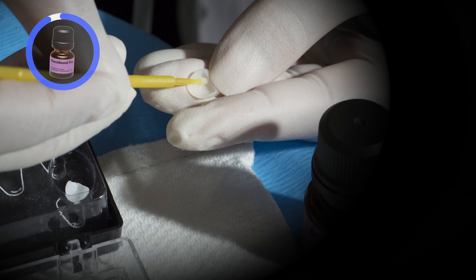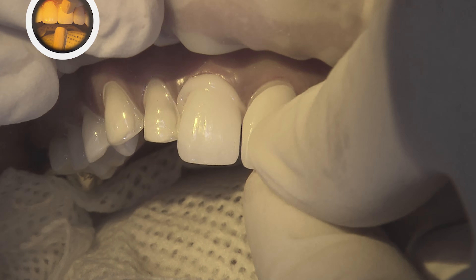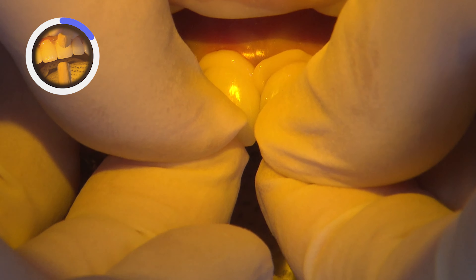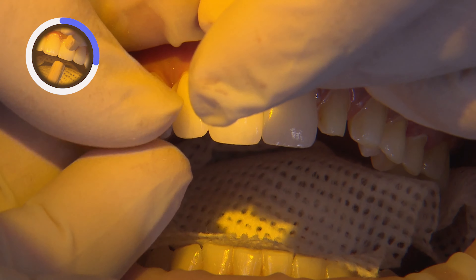These veneers have already been air-abraded with aluminum oxide at the lab. After we try them in, we need to prepare these zirconia veneers for bonding. To ensure we have a pristine intaglio surface for bonding, we scrub Ivoclean for 20 seconds on each veneer to remove any salivary phosphates that may have adhered during the try-in.